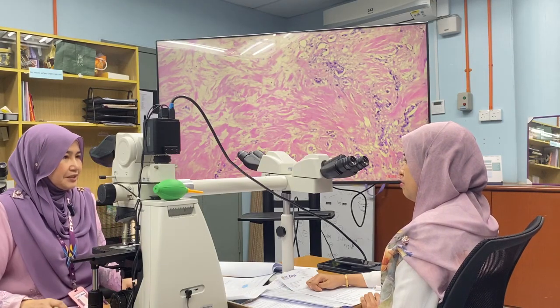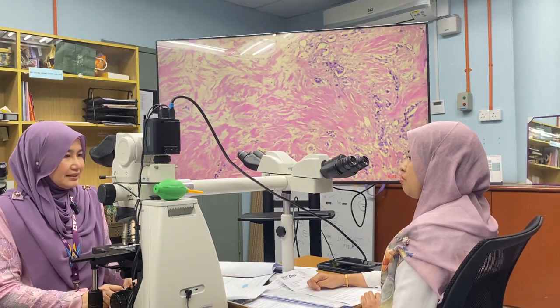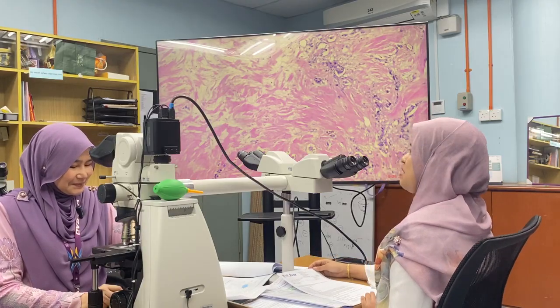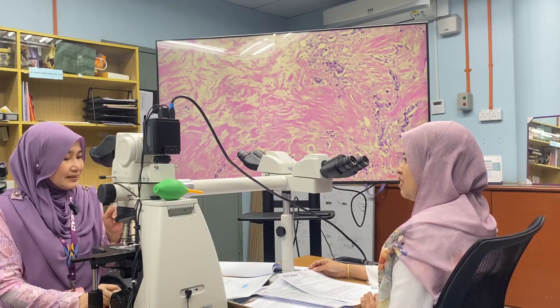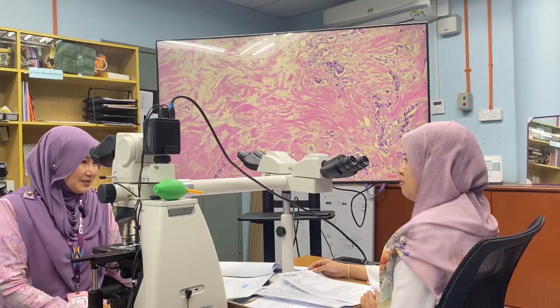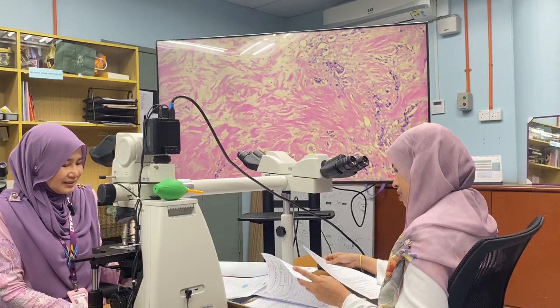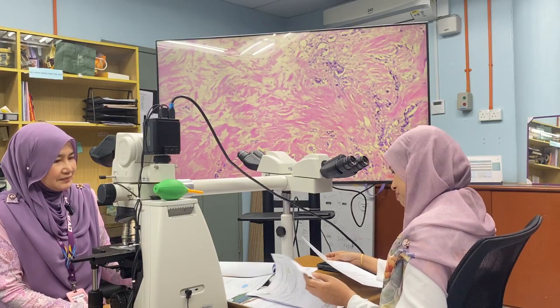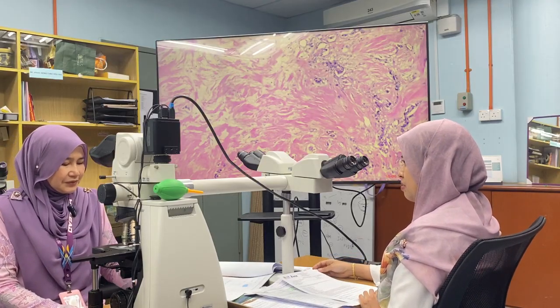So the number of lymph nodes here is 9, right? Yes, I identified 9. Do you think that's enough? It's supposed to be as many as possible, but the minimum is 10. Yeah. And then one more thing is the largest diameter of the tumor metastatic focus. So do you measure the largest? The largest is 10 mm, 10 mm within the axillary lymph nodes.